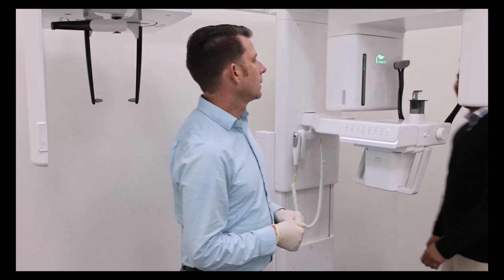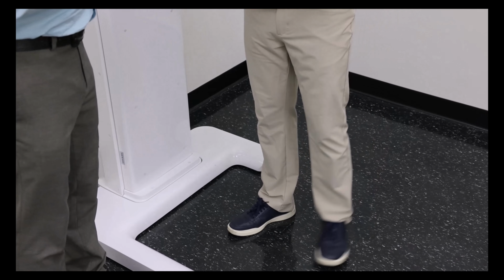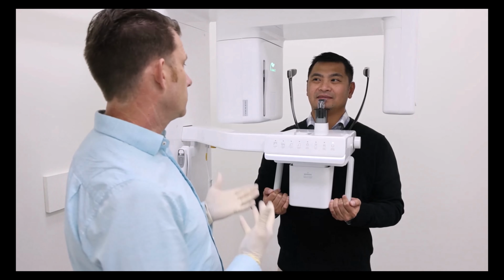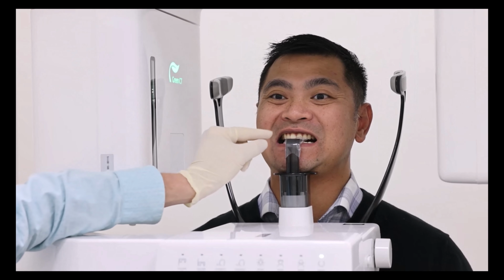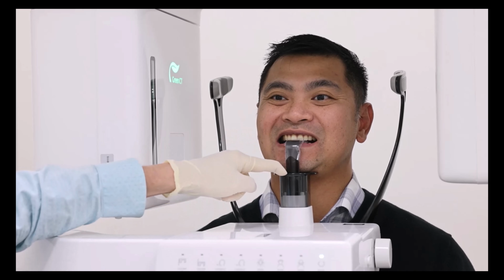I'm going to go ahead and bring my patient back. Go ahead and stand up straight and tall, and come forward. Start with your hands, palms facing up. So I have my patient positioned. I'm going to have them bite on the bite stick. I can see they're in the bite stick groove. I'm going to push down to ensure their chin is firmly on the chin rest.